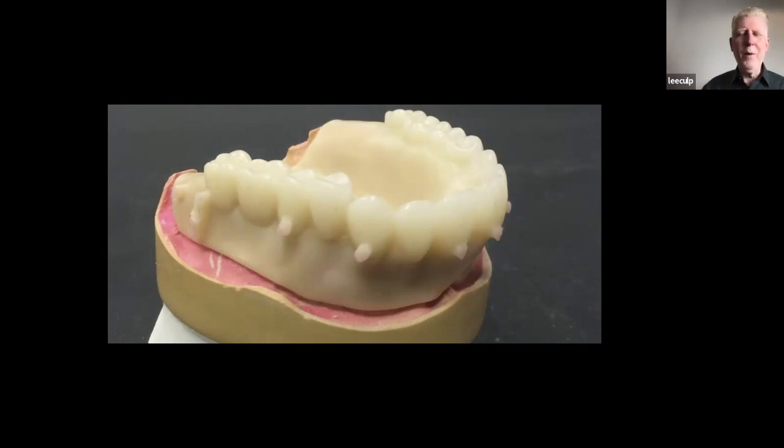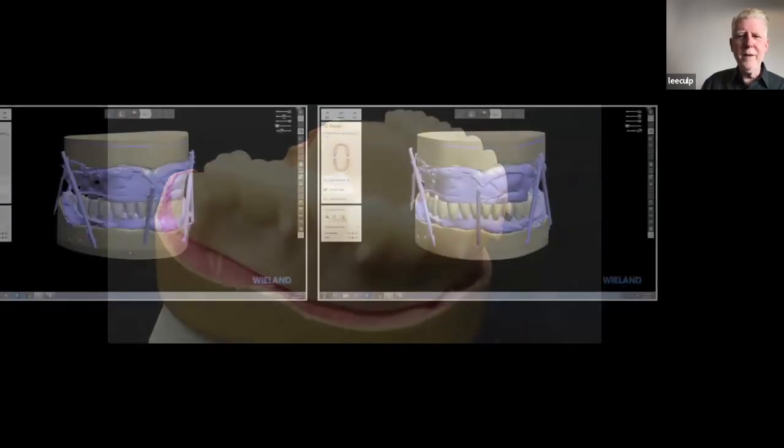And my wife calls me one night and she goes, "Are you coming home?" I said, "I've milled this denture 5 times and I can't get it to fit." And she goes, "What are you talking about?" I said, "I can't get it to fit the model. It won't fit the model." She goes, "Baby, dentures never fit the model. There is no model." And I'm like, "Well, how do you check it? How do you know if it fits? How do you know if it's going to go in the mouth?" She goes, "They just do. It's okay, but you're never going to get it to fit the model." And I'm like, okay. But this was our first monolithic dentures.